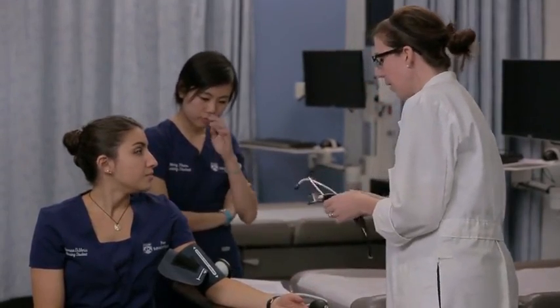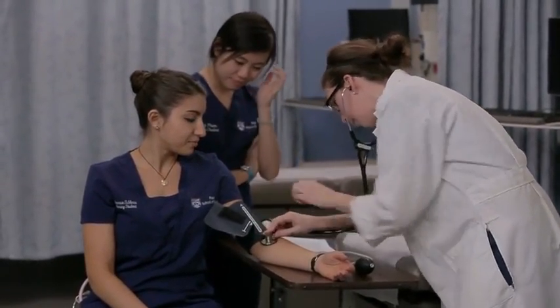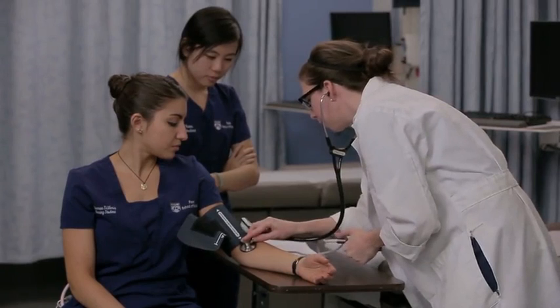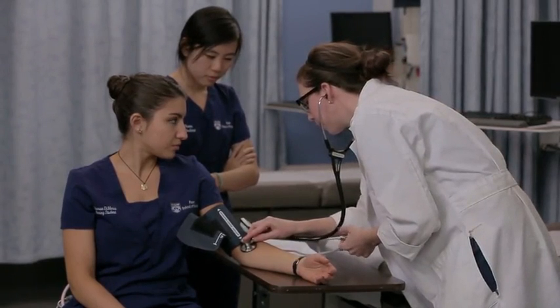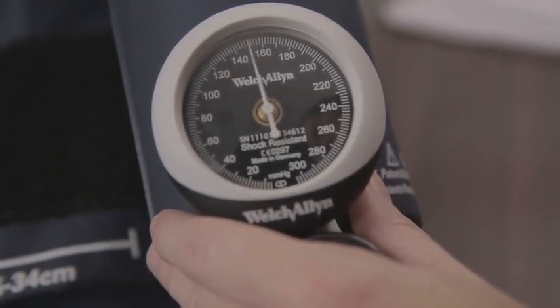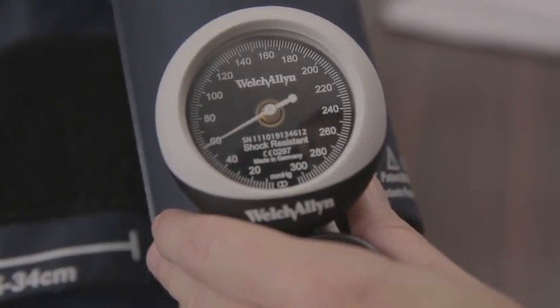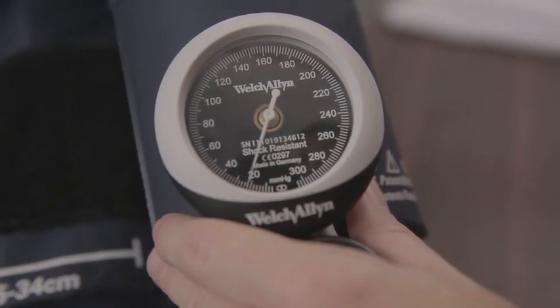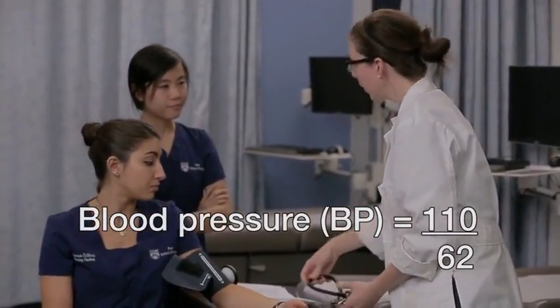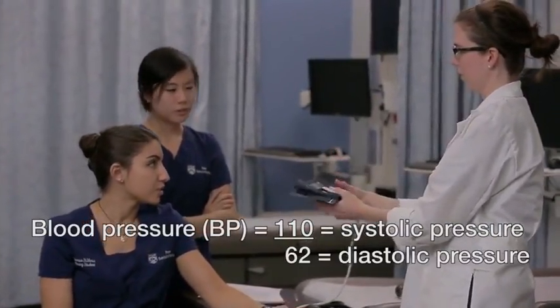There we go. Okay, 110 over 62. Now, what is that top number? It's called the systolic pressure. And the bottom number? It's the diastolic pressure.